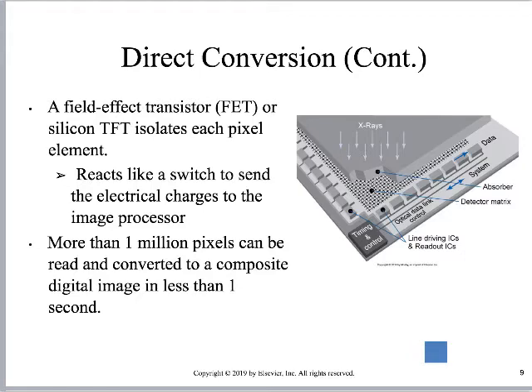And then more than 1 million pixels, and that's important because if I had to make a detector array that was made out of 1 million parts, that would be a very, very sensitive system, right? And by sensitive, I mean easy to break, easy for it to malfunction, all sorts of things. Electricity would be interfering with every part of the process. So we made these things larger and allowed them to sort through for different pixel sizes. So we'll look at that again.